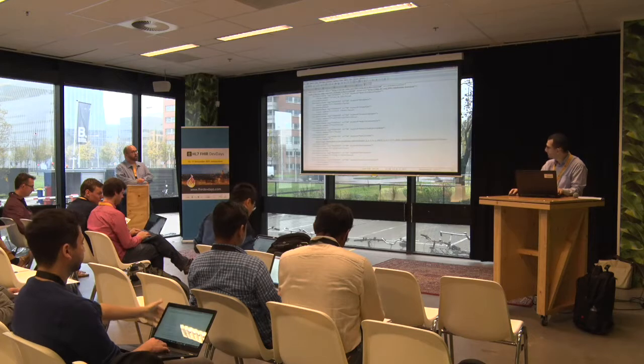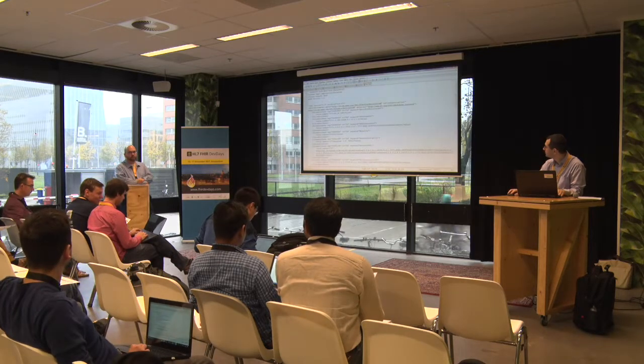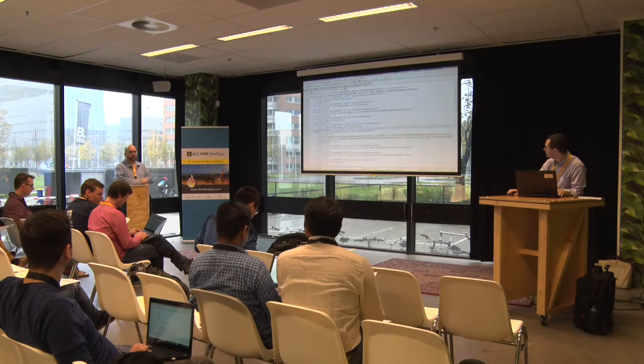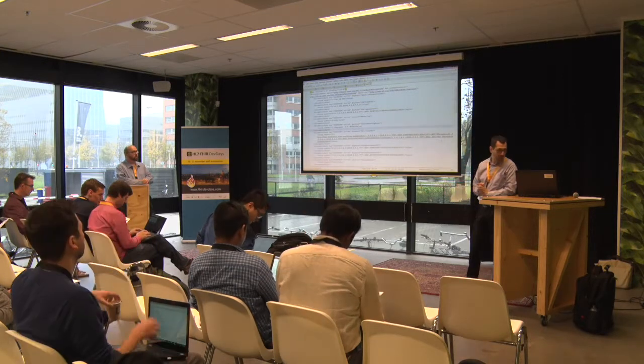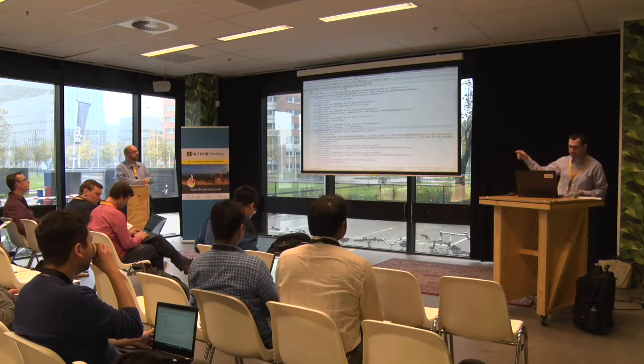DICOM solved the problem of what if you have an accession number from Hospital 1 and also from Hospital 2. By using study instance UIDs, each institution has to have their own OID starting point, and they register that globally, and that way when they generate images, it's always going to be globally unique. In here you see it's actually returning more information about the study.